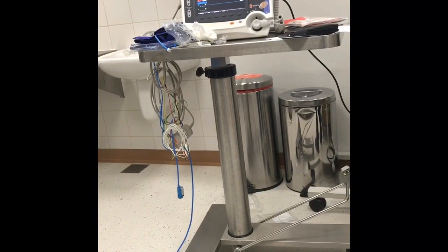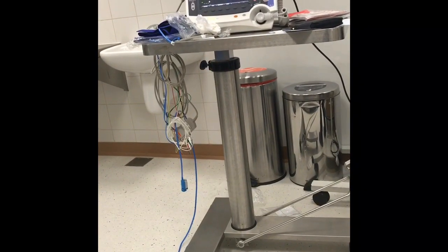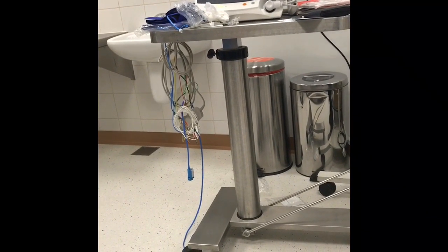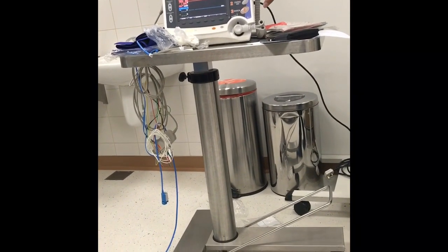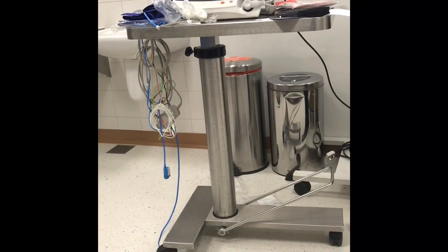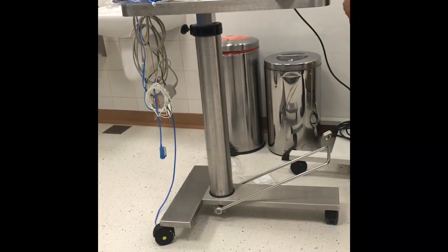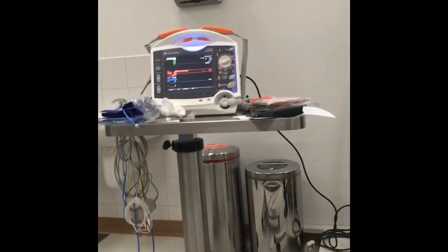Now this is the manual, from 2 to 270. Select the energy, charge, then discharge. Now with dual shock, biphasic, 200, it is very fast. If you are charging to 270, we need 5 seconds, then discharge.